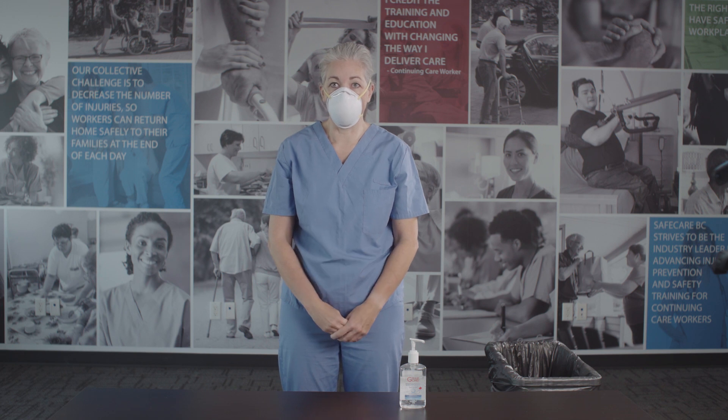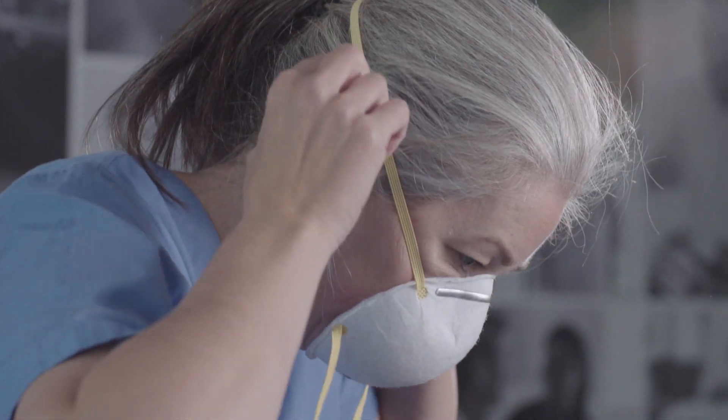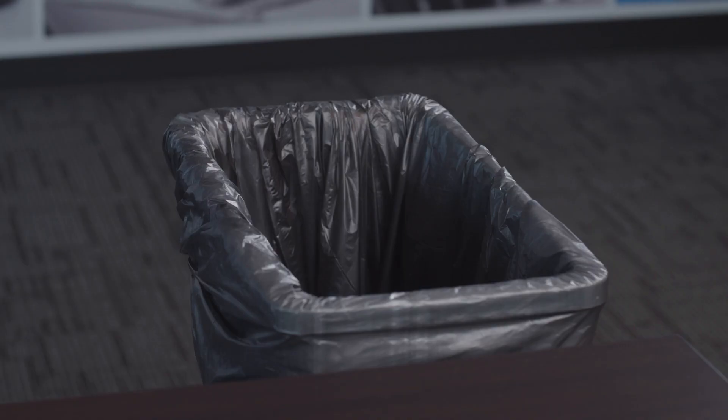For an N95 respirator, grasp the bottom strap at your neck and bring it over your head carefully. Grab the top strap at the crown of your head and bring it over your head. Lean forward and allow the respirator to fall away from your face without touching its front surface. Place in a receptacle for reprocessing or in the garbage bin.